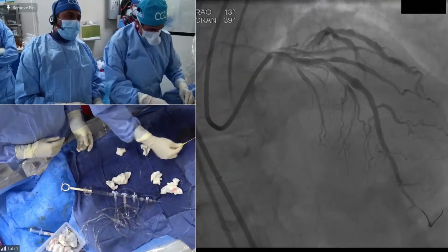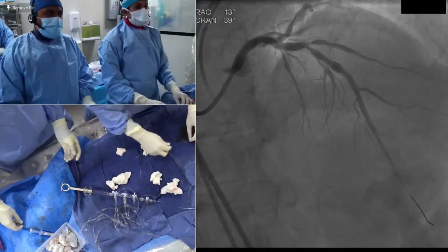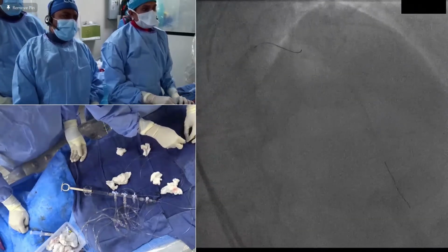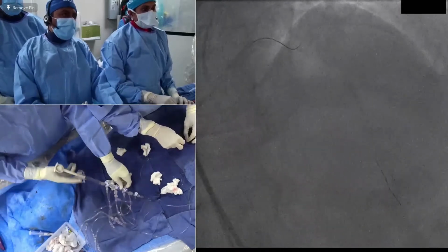Yeah, I would massage the distal segment of the stent. It looks to me like either spasm or pinch there, or plaque shift. So gentle, just go. That's great. So let's pass the wire first into the diagonal in order to be ready for further action in that vessel.